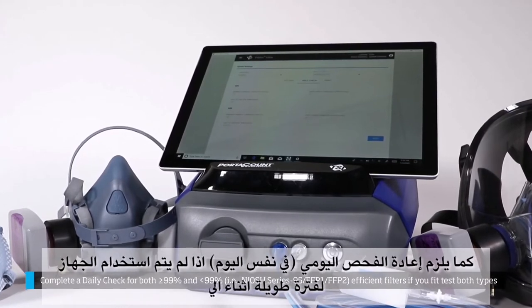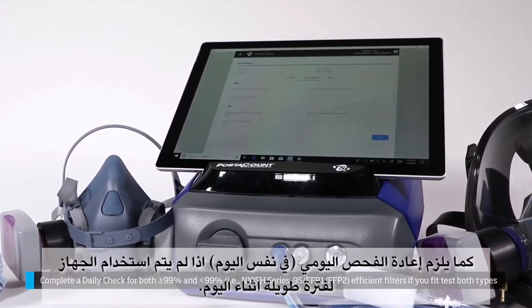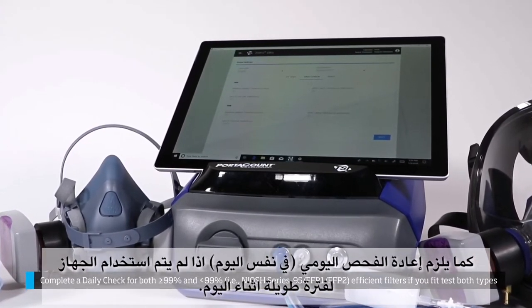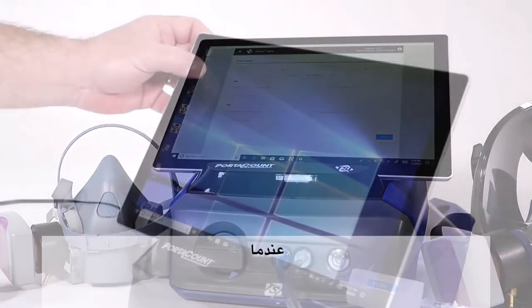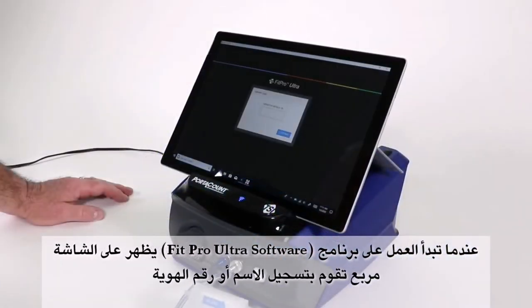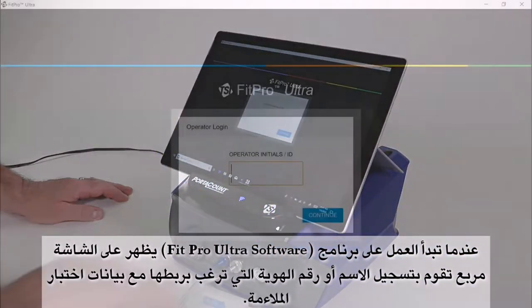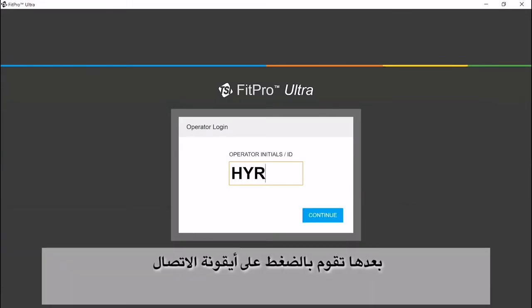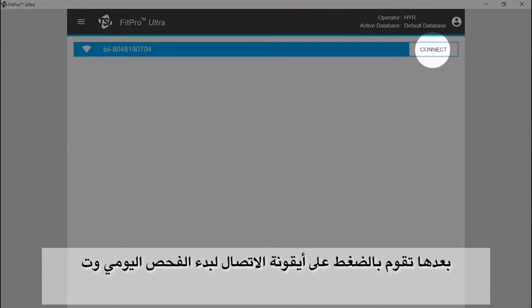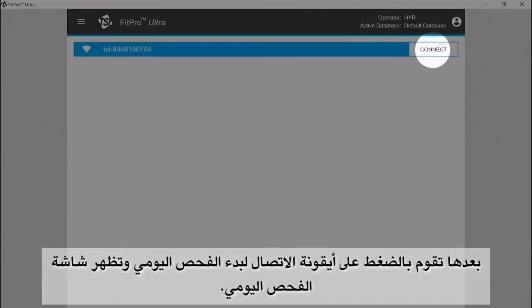Repeat the daily check if you have moved to a different fit testing location or taken an extended break during the day from fit testing. When you first launch FitPro Ultra software, you will be prompted to enter your initials or ID to be associated with fit test records, then select the connect icon to connect your PortaCount.